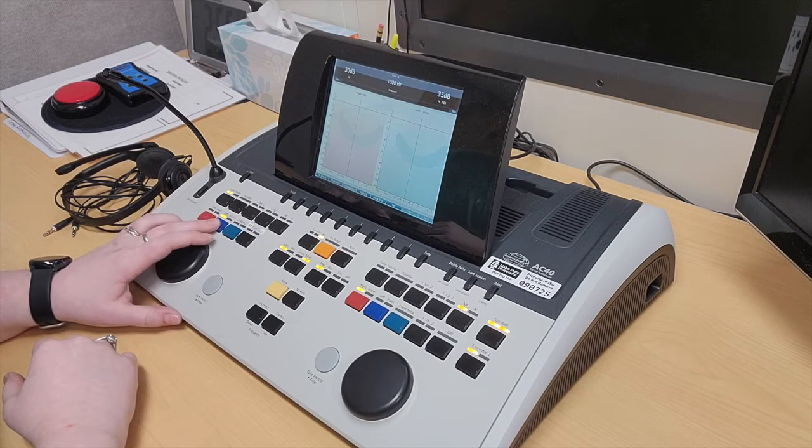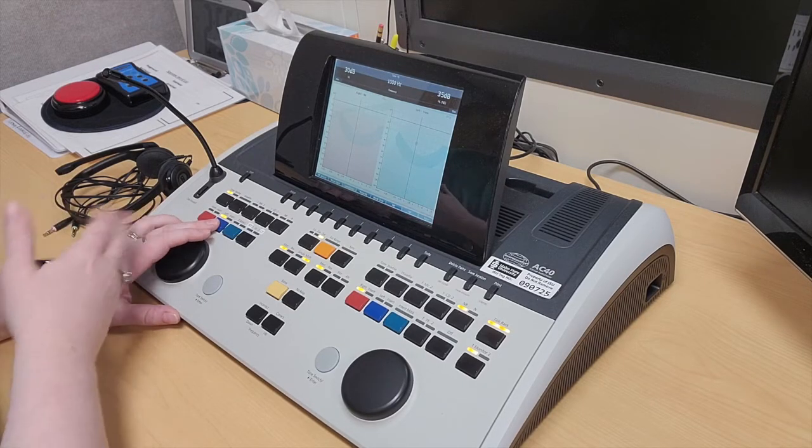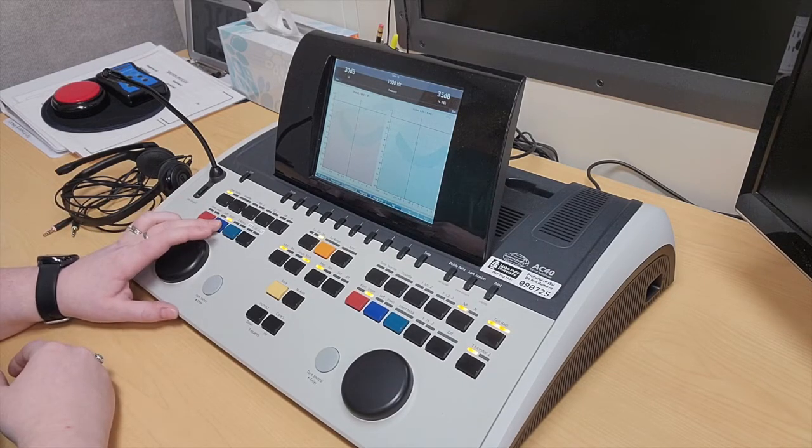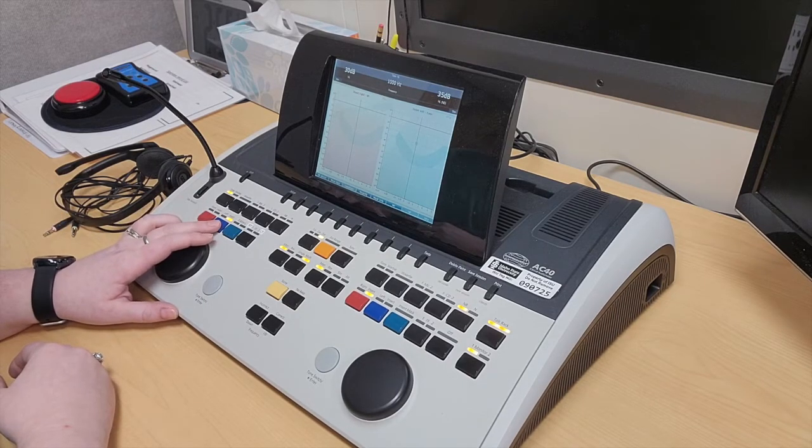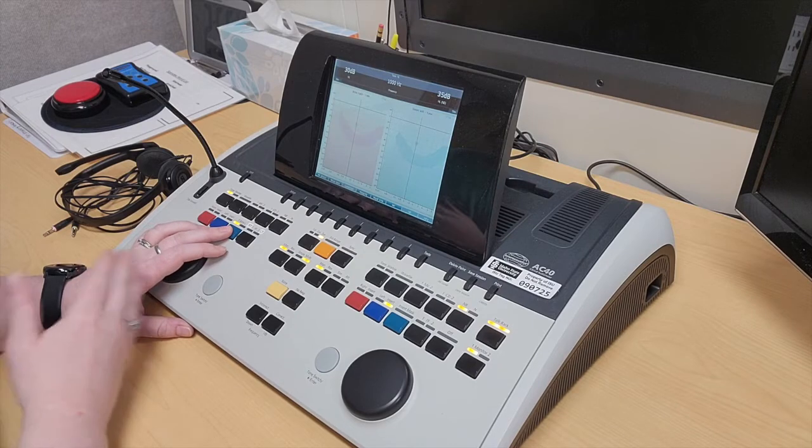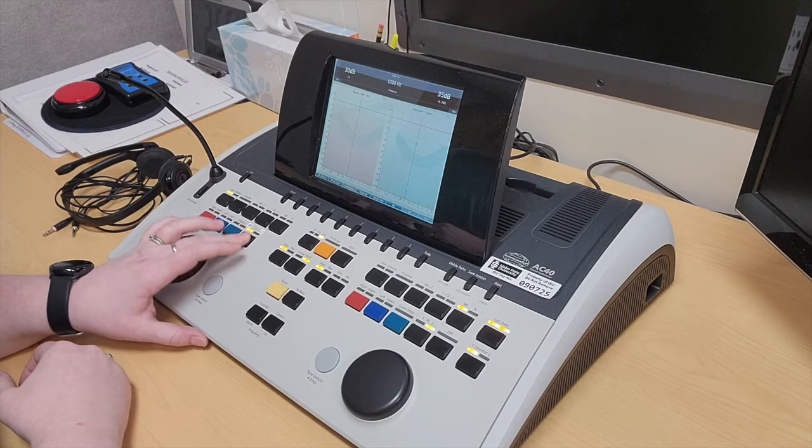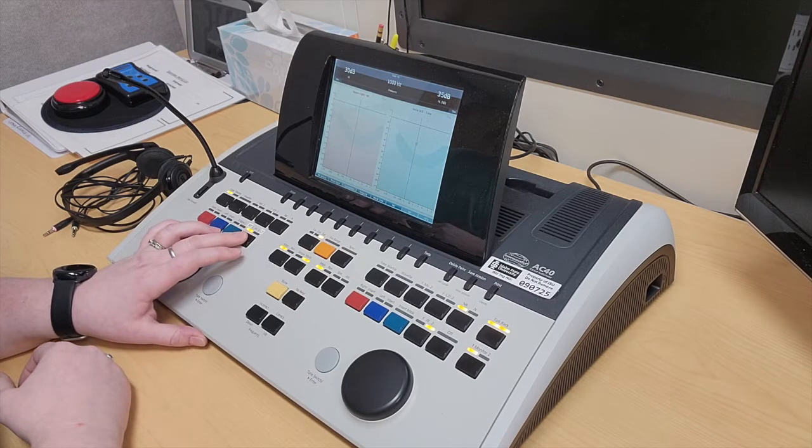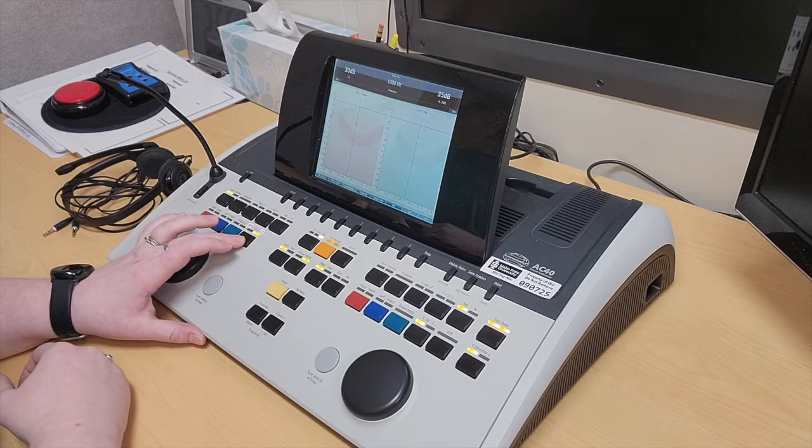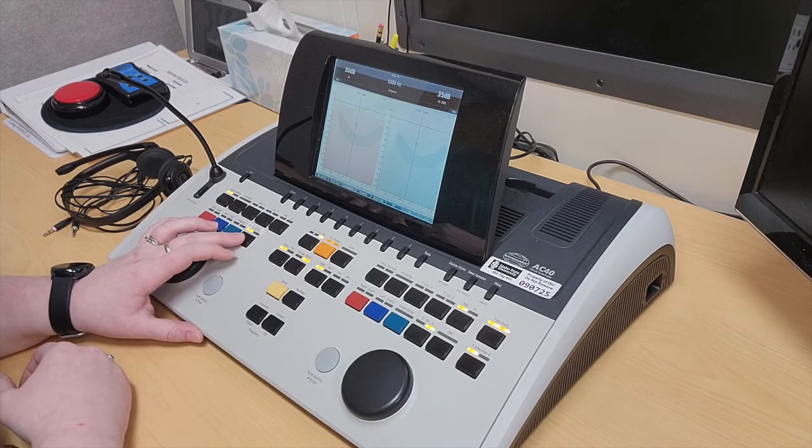This is the right button, this is the left one. Right now it's on supra-aural, and then I can change to insert. This one here is bone, right and left, and then this is speaker or sound field.